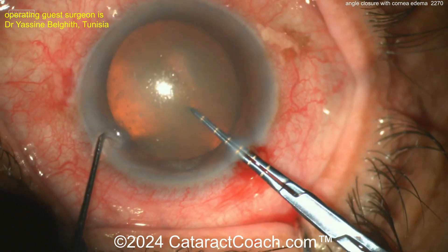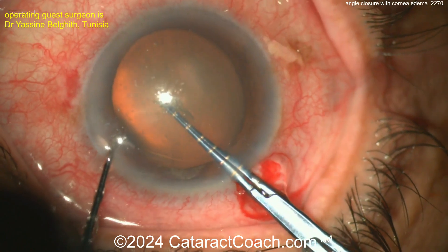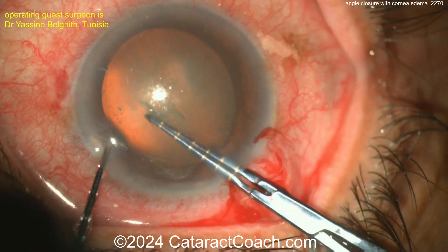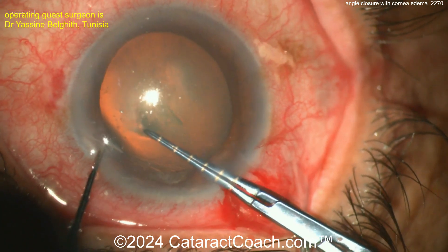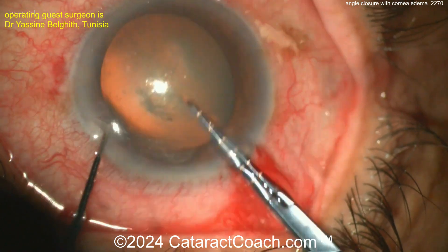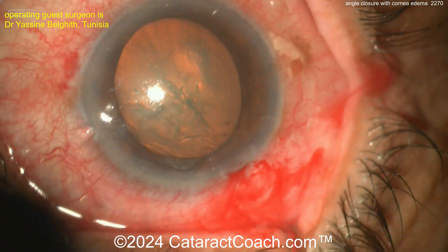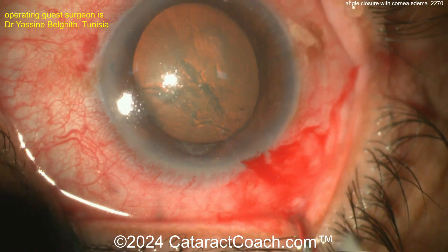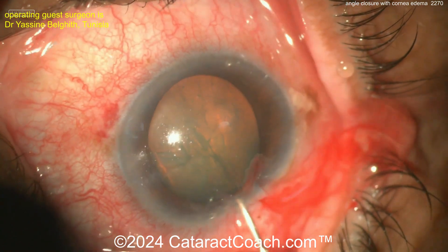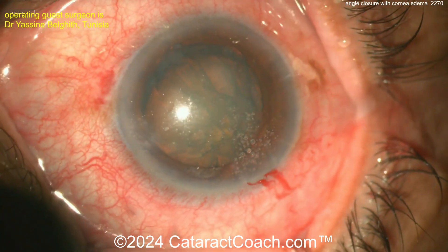In a patient like this, you're going to remove a cataractous lens that's four and a half to five millimeters thick in anterior-posterior dimension and replace it with a very thin IOL that's about a millimeter in thickness. What's going to happen? You'll get a much deeper AC, restore angle anatomy — that angle is going to go from closed or very narrow to very normal and deep, and that shallow AC will go to a normal AC.